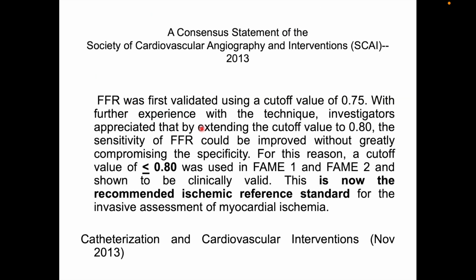But a consensus statement of the SCAI came out in 2013, which I'm going to read for you: FFR was first validated using a cutoff value of 0.75. With further experience with the technique, investigators appreciated that by extending the cutoff value to 0.80, the sensitivity of FFR could be improved without greatly compromising the specificity.